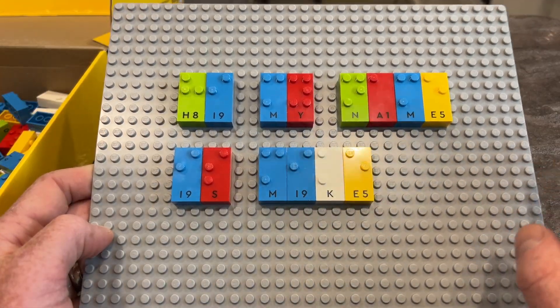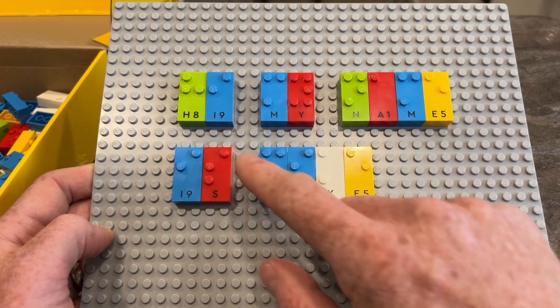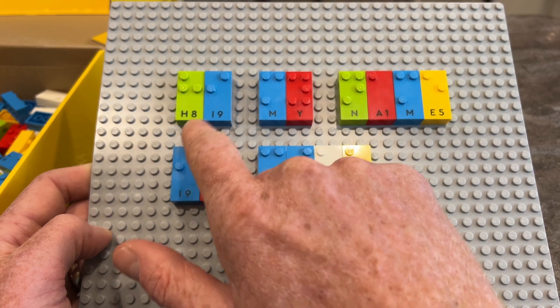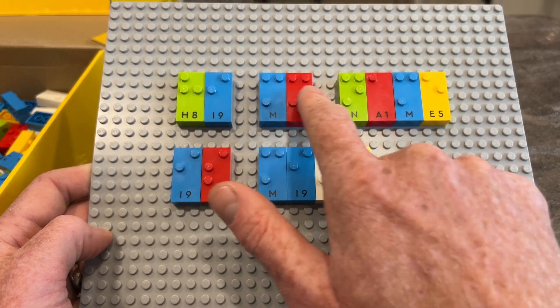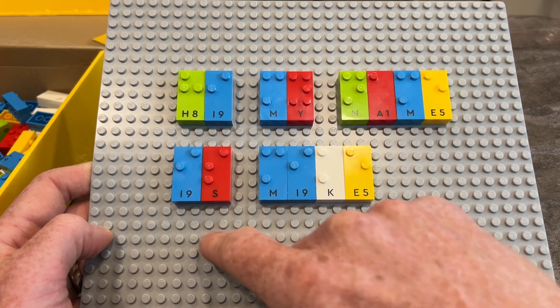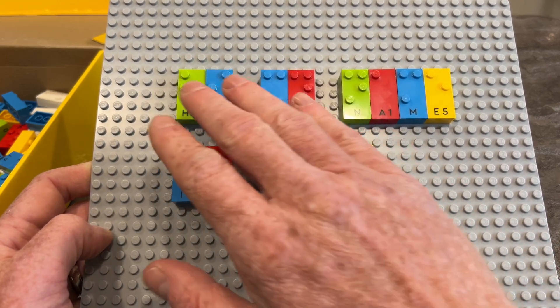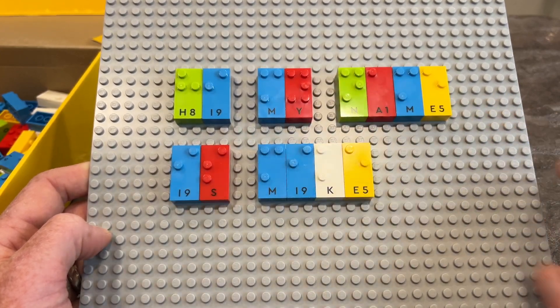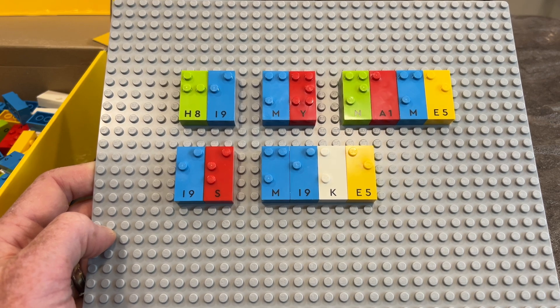Here's one last example of how these Braille bricks can be used to practice and learn Braille. This time I created words. The first word on the gray square is 'high' — a green H and a blue I. Then 'my,' with a space in between. Then 'name.' And then we have a blue I and a red S for 'is,' and then 'Mike.' This is also a great way of tracking the different Braille pieces and dropping down a line. There's a lot you can do with this, especially if you're creative, to really develop and practice those Braille skills.